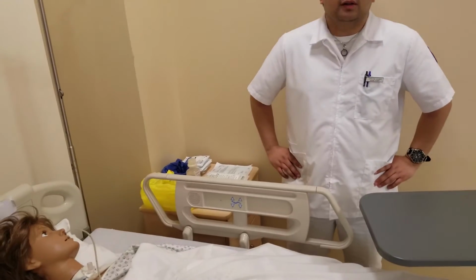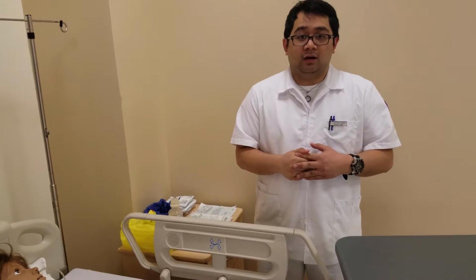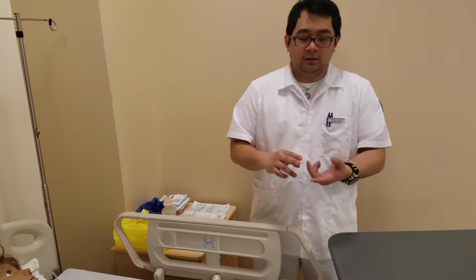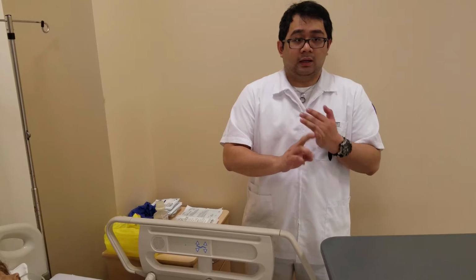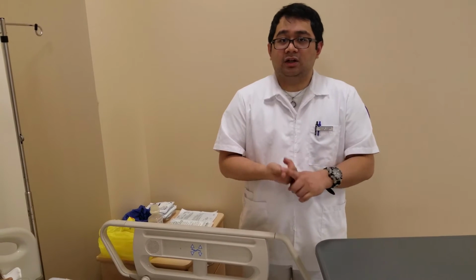I'll be doing my video validation, doing a wet to dry dressing on my mannequin patient over here for section 602 of nursing foundations. To begin, I'm going to read off the 7 rights that you should do before even interacting with the patient. They are to identify the patient, introduce yourself, check physician's orders, provide for privacy, do your own hand hygiene, gather your equipment, and explain the procedure to your patient.